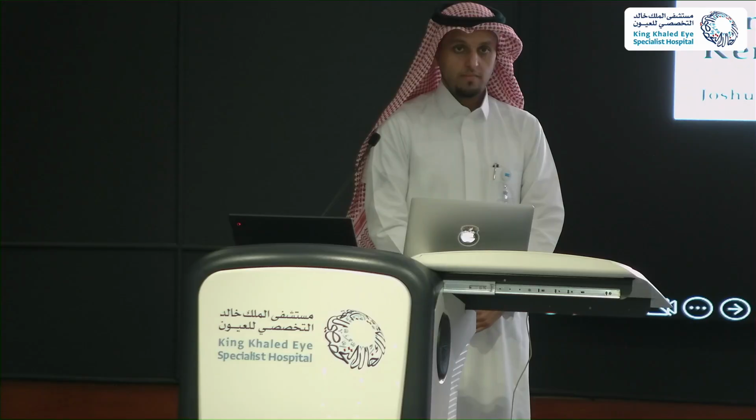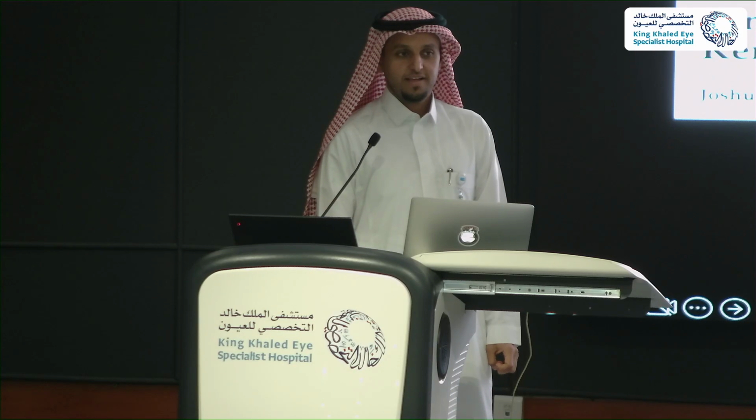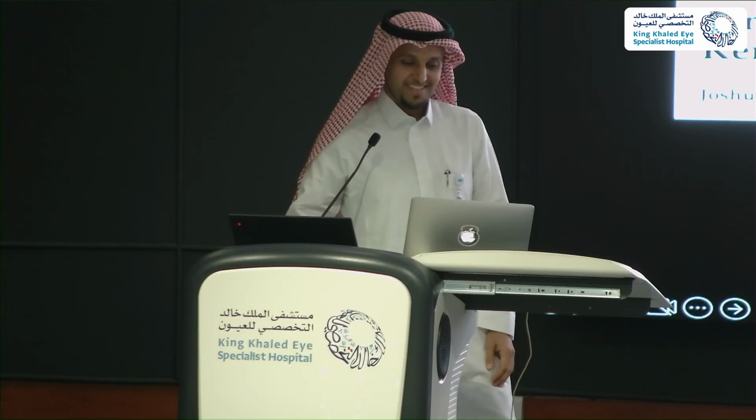So skills is important for the treatment. Also, to have the new advances in technology is very important. Sometimes it delays us rather than helping us. You go to the Femtosecond room, then shift the patient to the surgery room. I hope there is a machine which can do it in the same room without moving, or the room will be prepared. I know there is. I'm talking about our hospital now. It will be prepared to do the Femto and at the same time do the graft, and that's it.